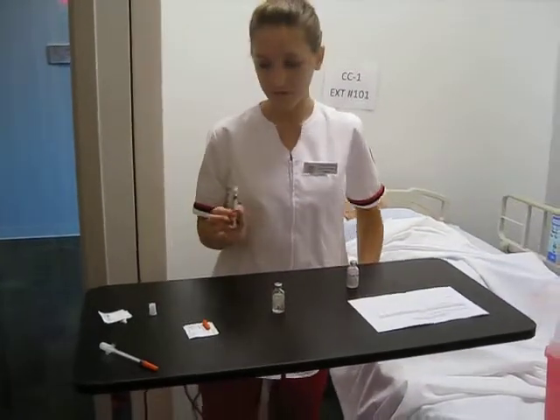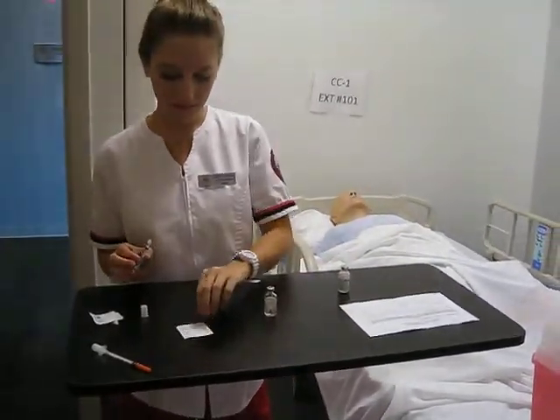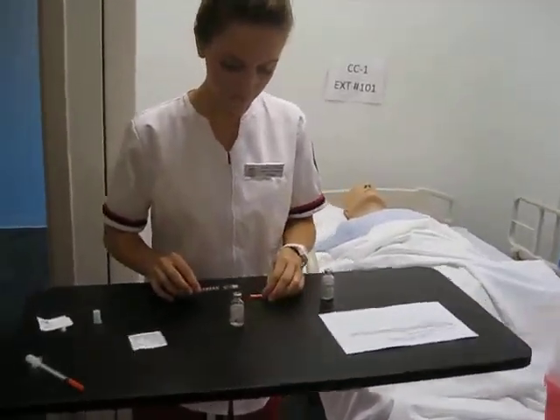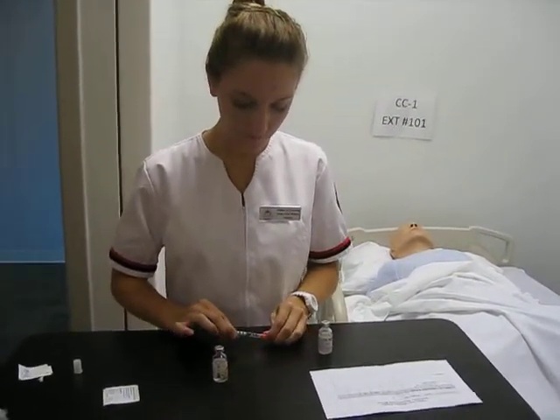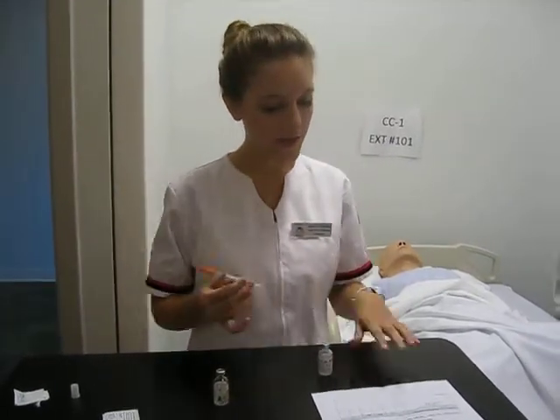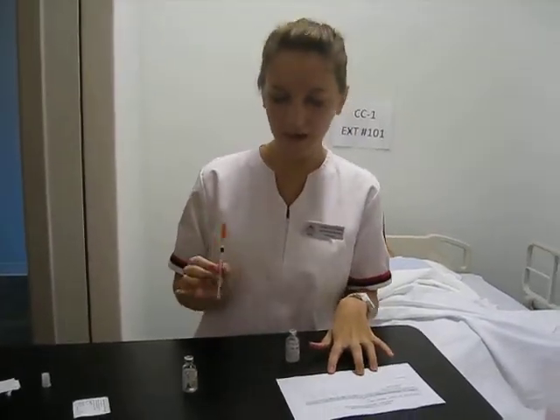Now I need to safely recap the needle, and I would again make sure that this was correct with my MAR before taking it to the patient's room.